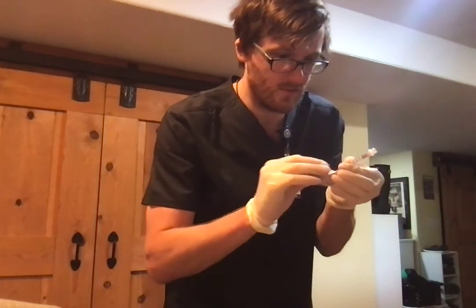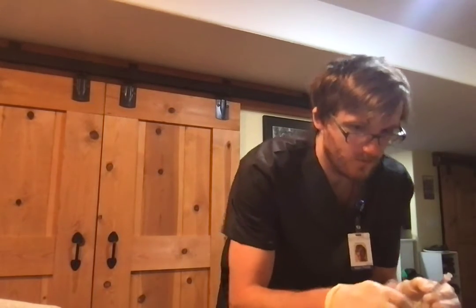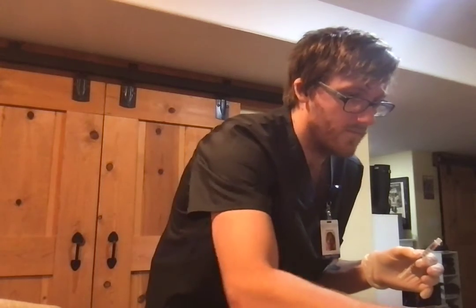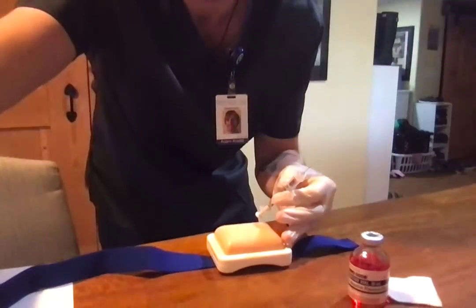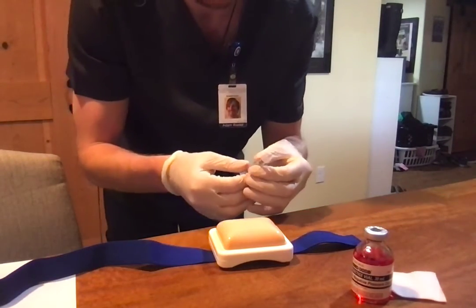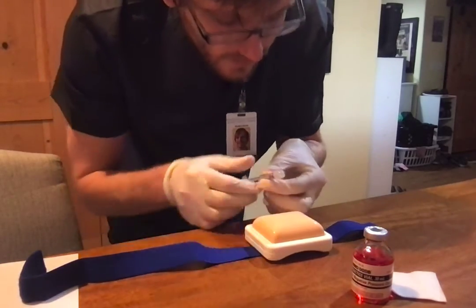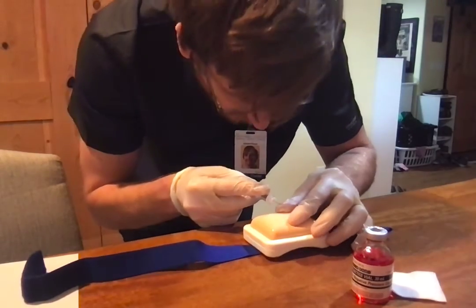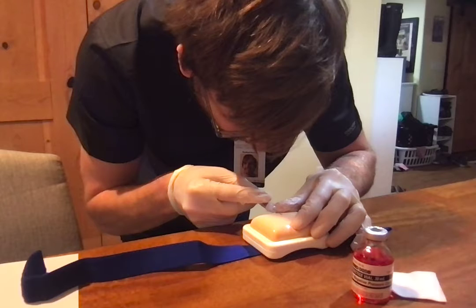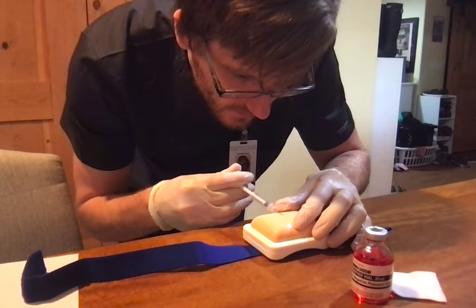And then I'm going to use a different alcohol swab on my patient. And I want to administer this at, I should probably show what I've been doing. Hopefully that's showed everything. I want to administer this at a 5 to 15 degree angle. So we'll go ahead and make our C, and I'll spread at 15 degrees. And since this patient's, there we go.